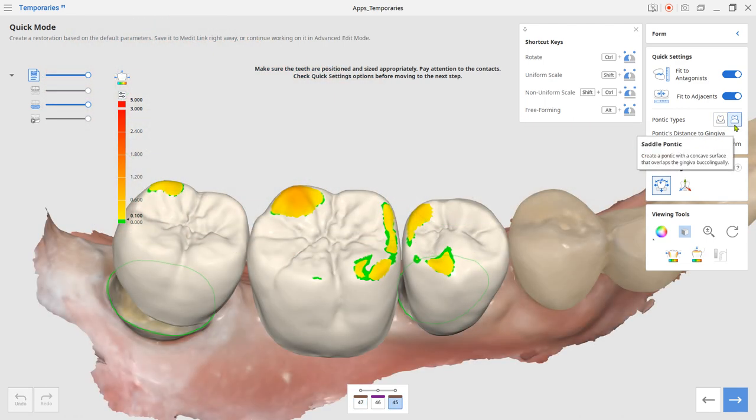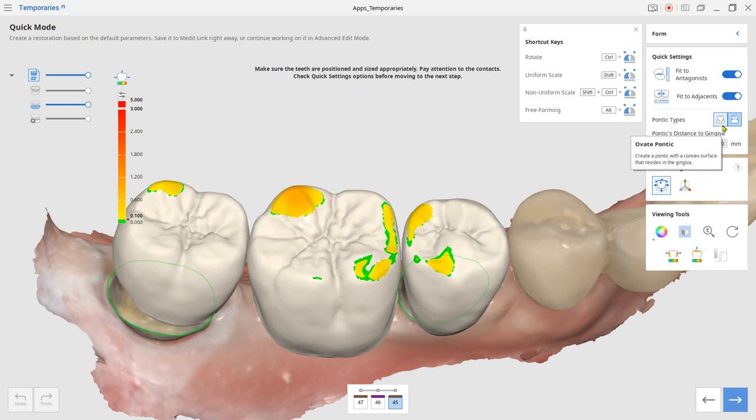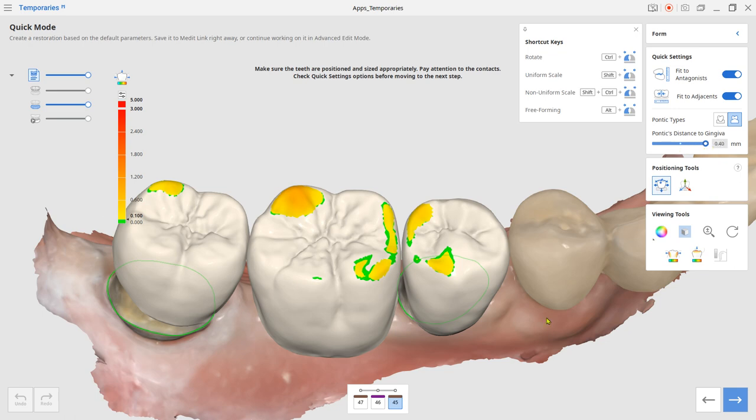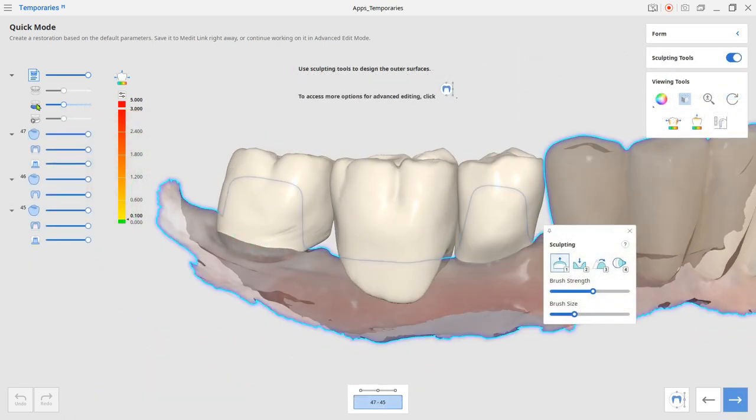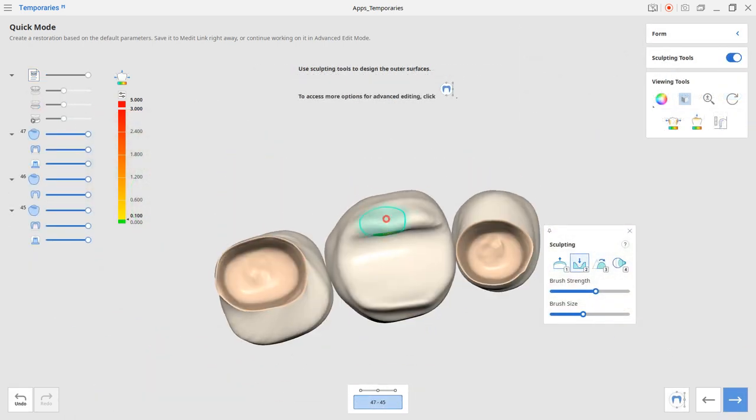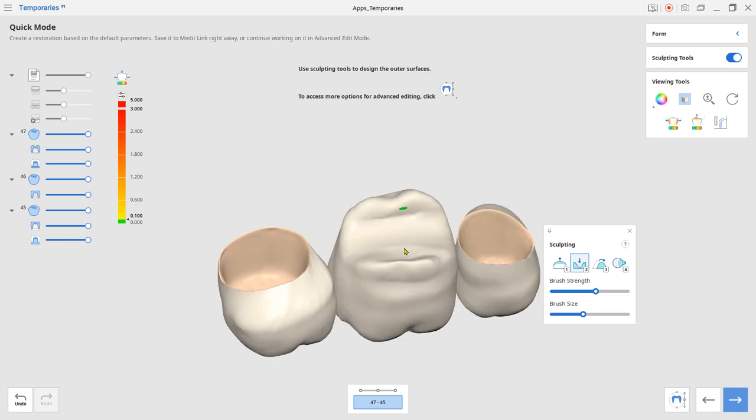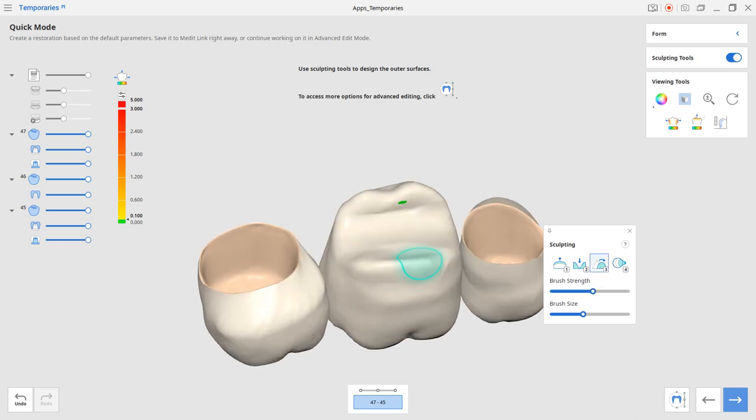You also have to select the bottom shape of the pontic, as in saddle or ovate. Next, adjust the exterior shape with the sculpting tool.